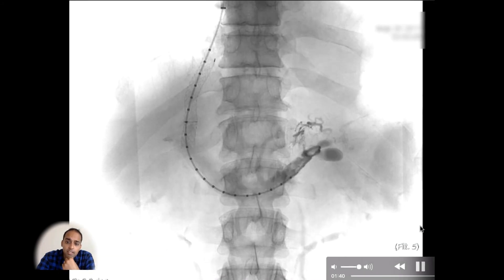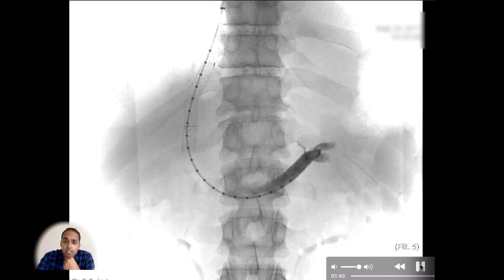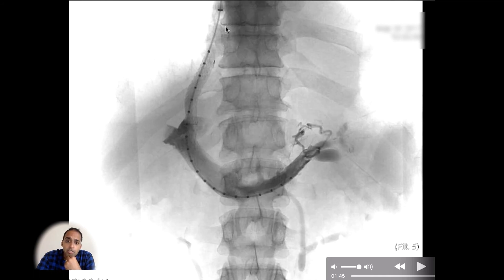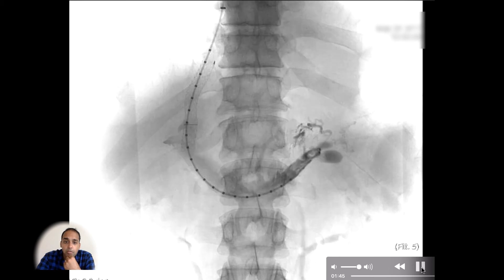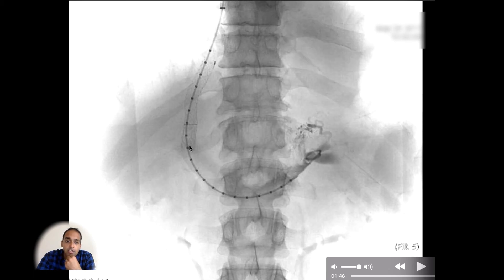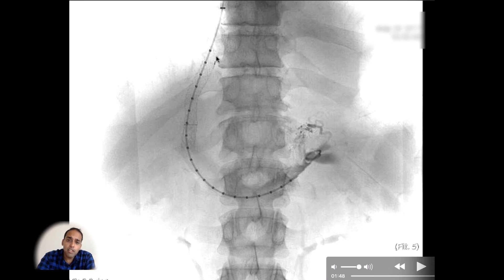This is what I would call the money shot — the set of images you always want to see in a TIPS. What you can see here is our sheath and a marking pigtail catheter with multiple side holes through which we are injecting — so again, this is a direct portogram. What has changed is that we've actually placed a stent here. You can see the TIPS Viatorr stent. This is the demarcation between the uncovered and covered portions, and now we've created a fistula, or a shunt, between the portal vein and the systemic circulation — basically into the middle hepatic vein or into the right atrium.